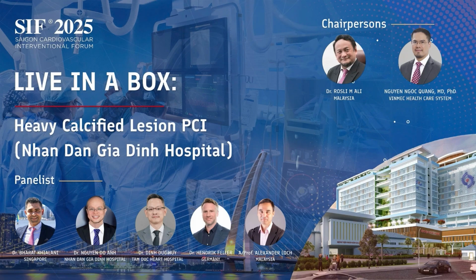But some Japanese people think we need volume reduction. Shockwave doesn't reduce volume. So with rotor or OS, maybe the bigger rotor, they sometimes say you should do volume reduction. So what do you think of the idea of volume reduction?